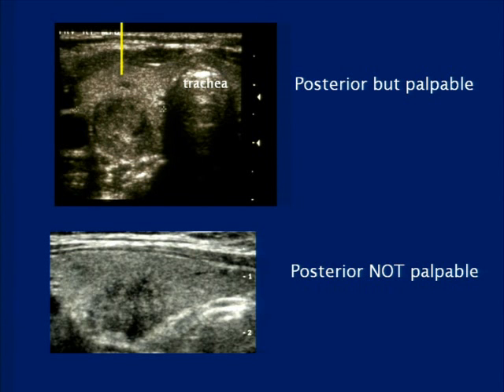And if you just biopsy by palpation, generally you're biopsying more superficially with that technique. And your likelihood is that your needle is going to be in that superficial normal tissue and not make it all the way down to the nodule. And so knowing where that nodule is on ultrasound gives you a better sense that this is a nodule that would be better biopsied with ultrasound guidance.